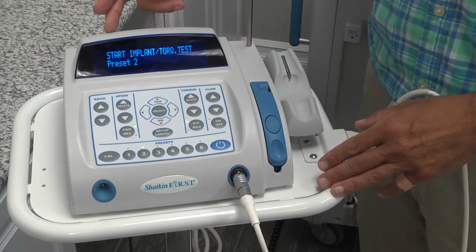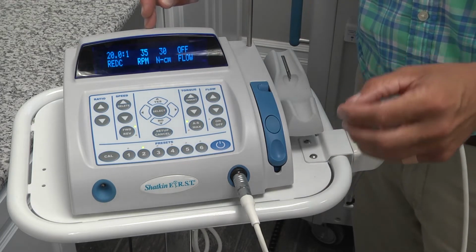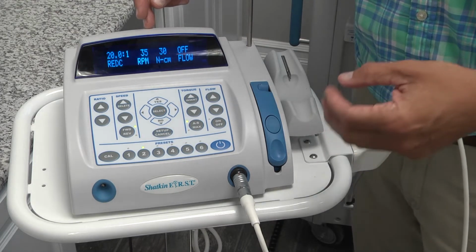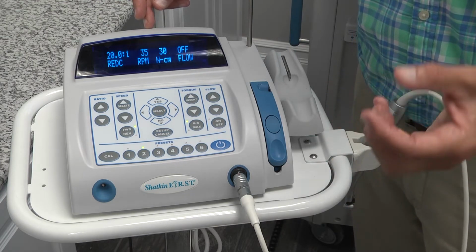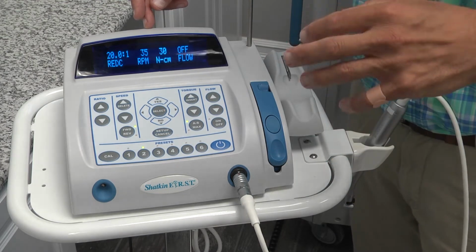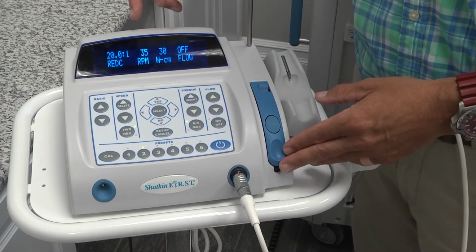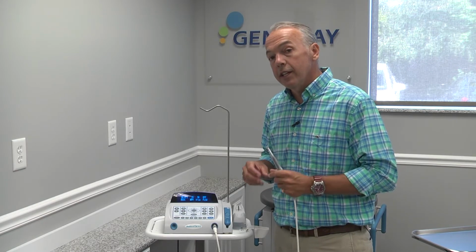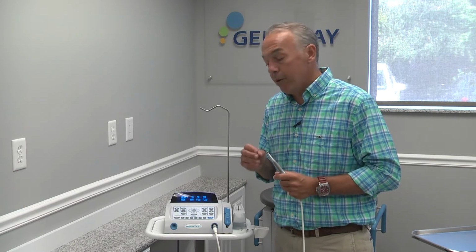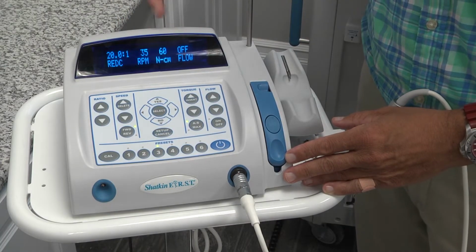Number two, start implant torque test. Same 20:1 ratio handpiece we're using. We bring it down from 2,000 RPMs in the pilot drill mode to 35 RPMs when we start to drill the implant. 30 Newton centimeters of torque, and we need no water for the implant placement. Only when we're drilling the pilot drill and creating a little bit of heat, we want to cool that bone down.